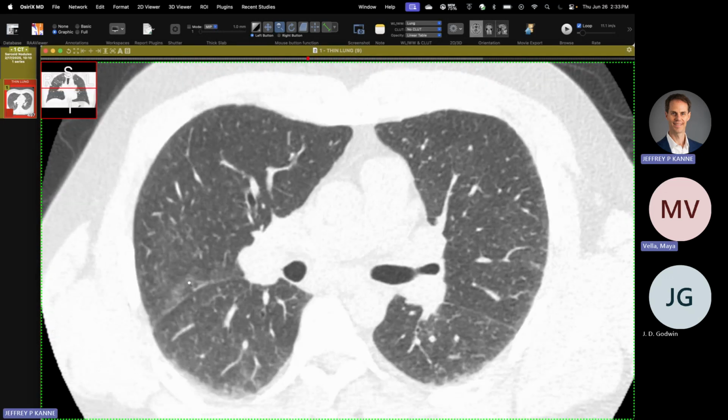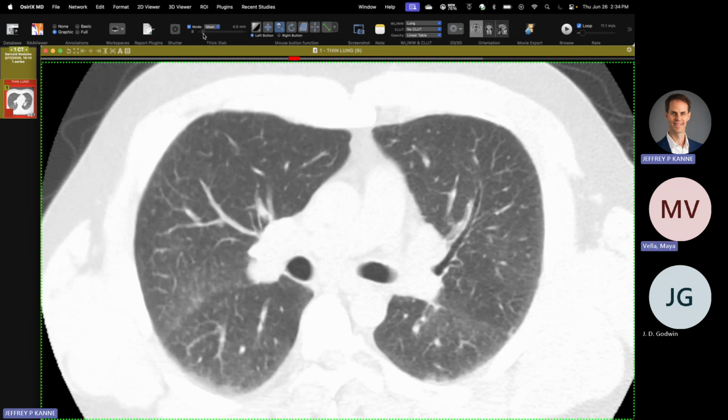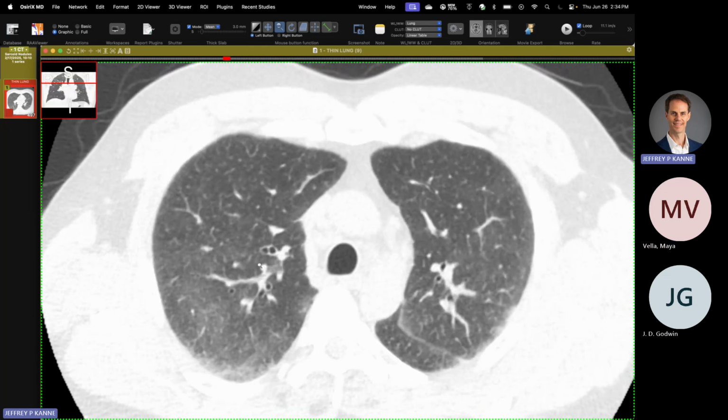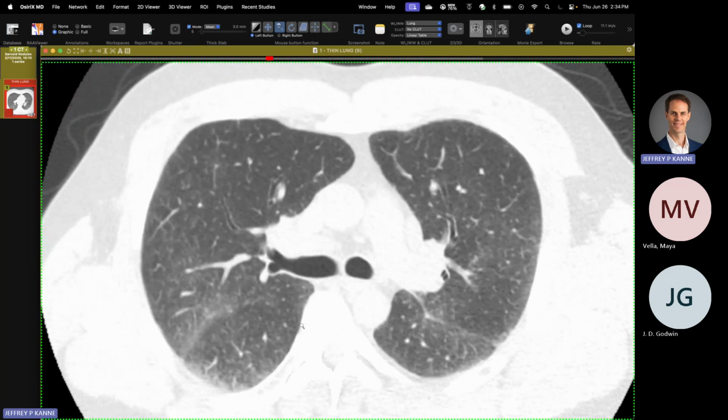and in the literature, there's description, and even some of the books, it describes ground glass opacity as a finding of sarcoid. And I suspect there are probably a few cases I've seen with some ground glass opacity that's real, but I suspect a lot of those are older cases of thicker slices. If we were to thicken this up here, let's say go to 5 millimeters all of a sudden, like they used to do back in the days, and sadly still occasionally do, those nodules may not look so nodular, and you can imagine this gets called ground glass opacity. So this is one that is a good case I show my trainees when they're a little bit more advanced to see if they can tease out the nodules.